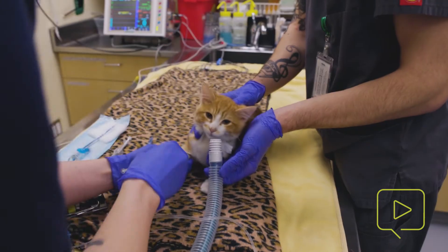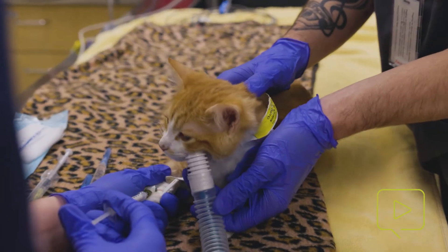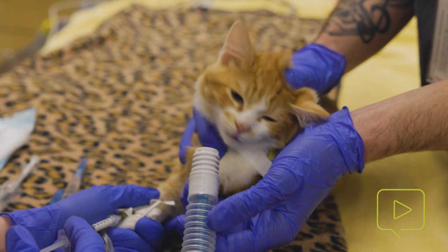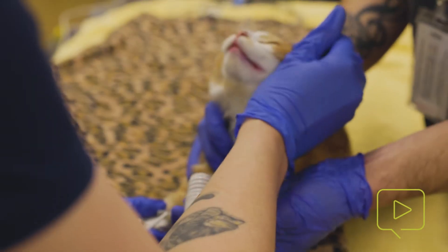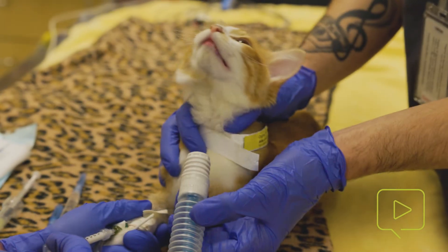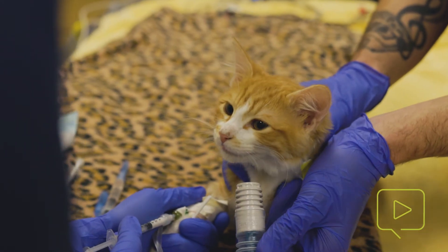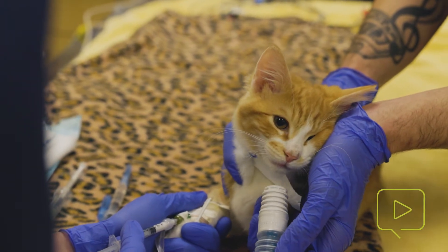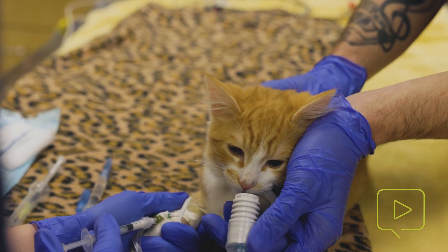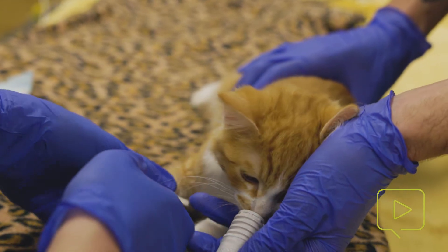We're going to begin induction with our propofol. I'm just going to give this slowly and a little bit at a time to effect until he's not chomping. We do give our cats midazolam, and that can kind of make them think that they're hungry, so sometimes they'll chomp on fingers or things around them. They get a little bit dysphoric sometimes. But we'll just continue to give that propofol to ease that effect. The goal is that we want him to relax enough that he does not have a swallow reflex and that we can safely get into his mouth.